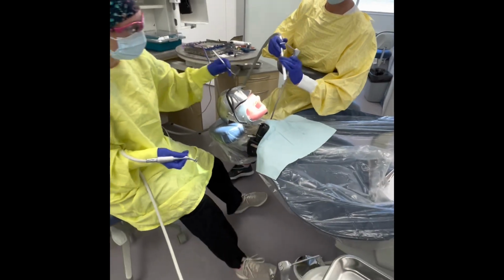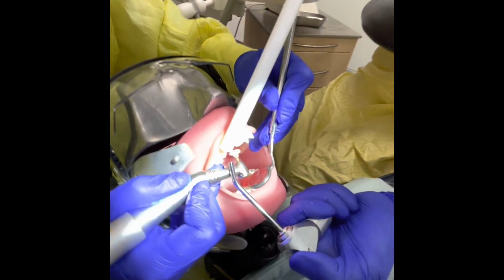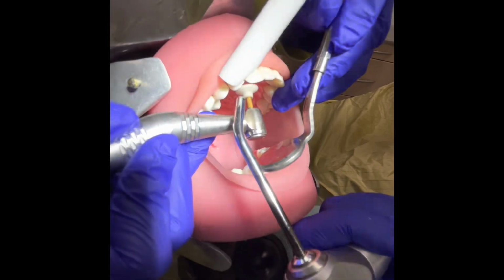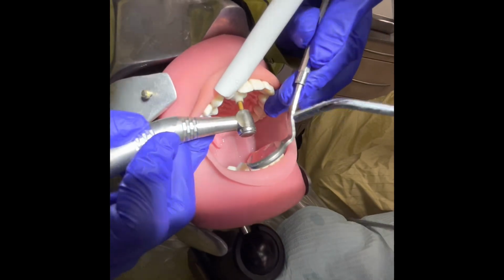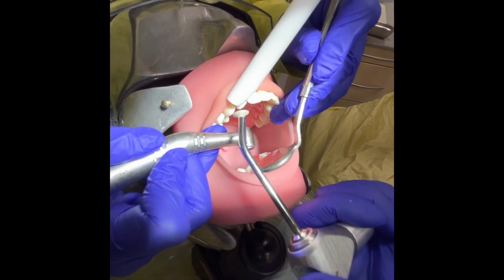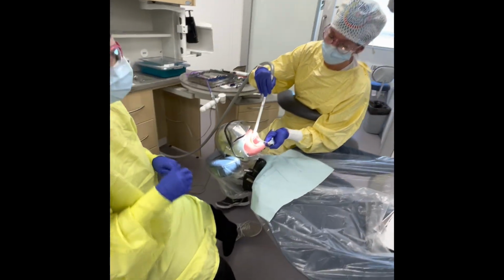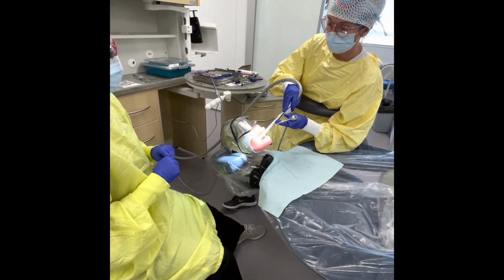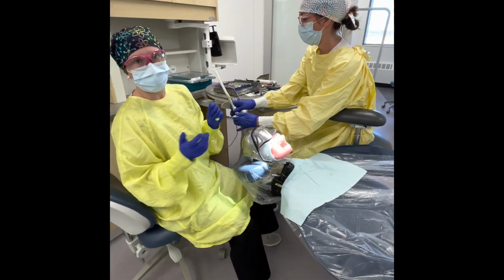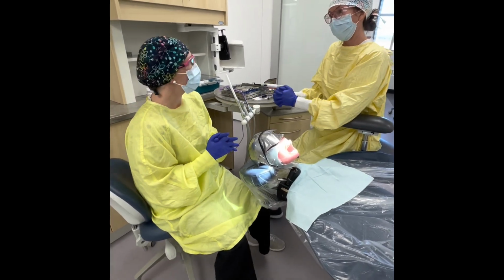Okay. So for this, Stacy's going to bring her suction and everything in again as well. She's likely still going to blow the air onto the tech because there's going to be debris that comes off of these little discs potentially, so it's nice to keep it clean. Okay, that looks much better. Thank you, Stacy. I'm going to give it a good rinse because that's going to be a little bit gritty afterwards. Okay, so this is one of those situations where your operator is likely just going to take their mirror and put it down. Okay, so our procedure is complete.